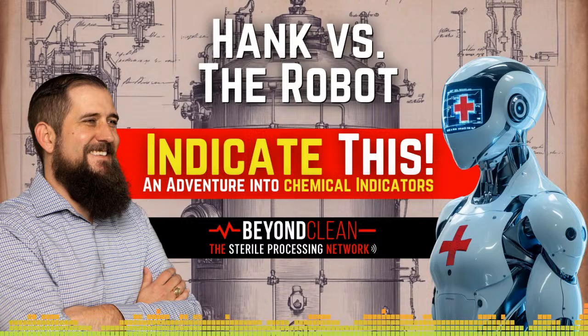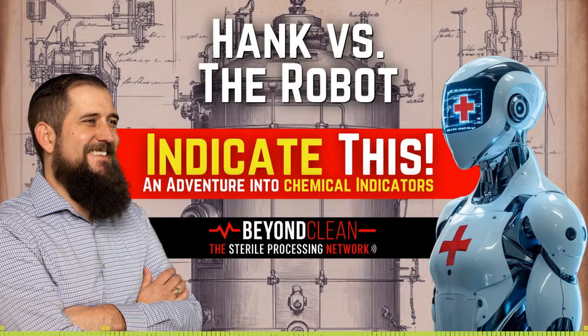One, reliance on machine performance. If every sterilizer cycle could be perfectly controlled, verified, and monitored by physical and digital sensors, you could theoretically eliminate the need for indicators. The sterilizer's internal monitors could validate time, temperature, and pressure, ensuring that cycles meet the necessary parameters. Two, data logging. Modern sterilizers already log sterilization cycle data. In a world without chemical indicators, we'd need those systems to be so advanced, foolproof, and tamper-resistant that they could entirely replace physical validation tools.